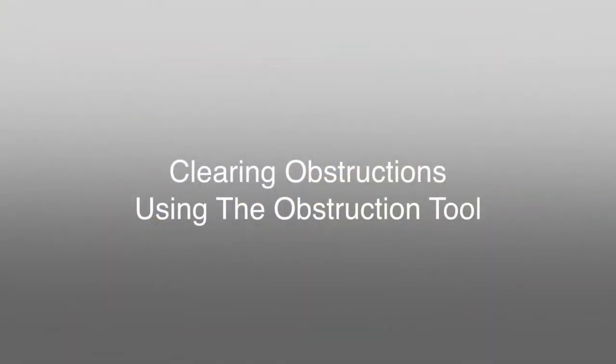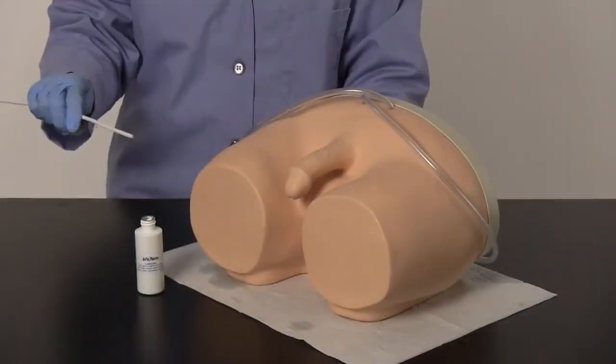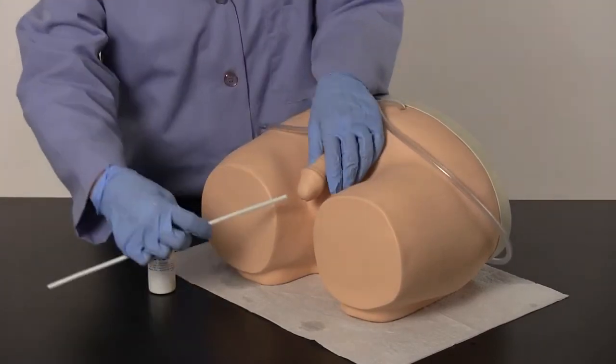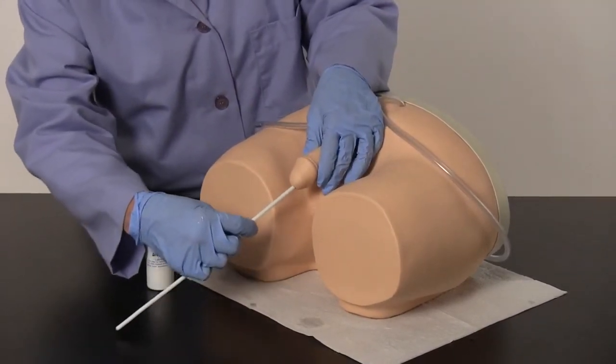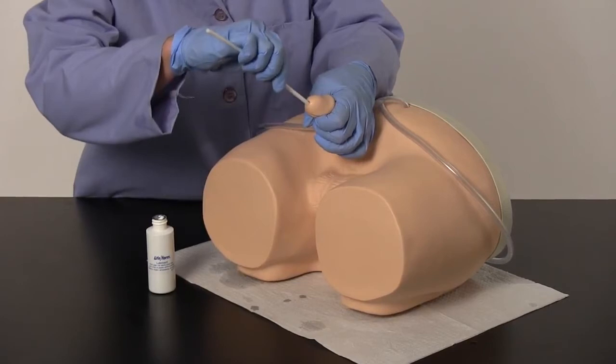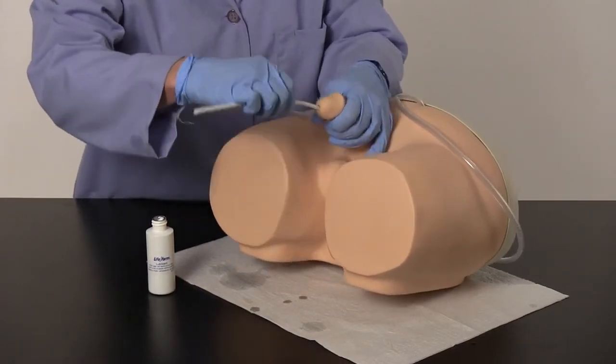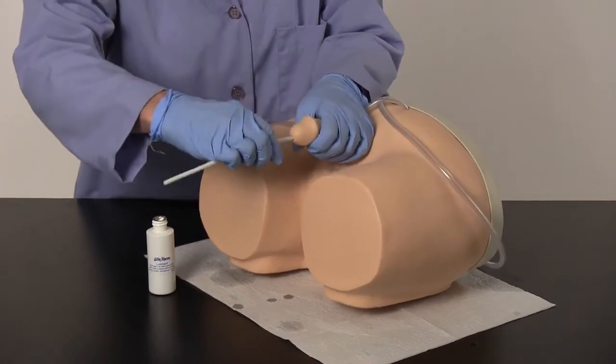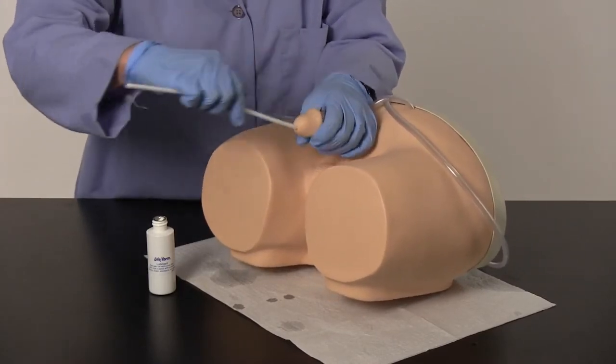Clearing Obstructions Using the Obstruction Tool. Generously lubricate the obstruction tool and insert it into the urethra following the same catheterization procedures. Remove and reapply lubricant as needed until the obstruction tool is able to enter the bladder. Follow this procedure by flushing the system with warm water to clear the built-up lubricant.